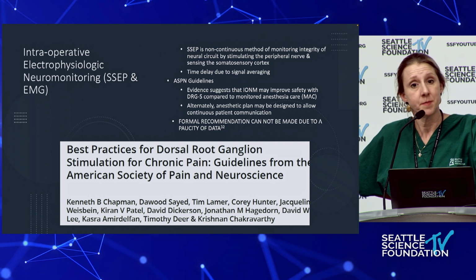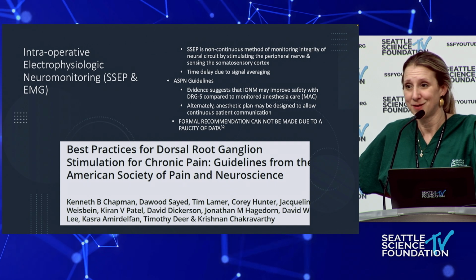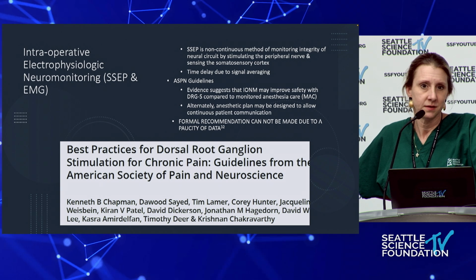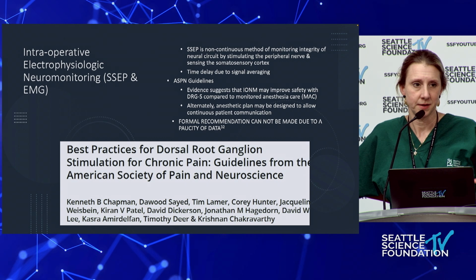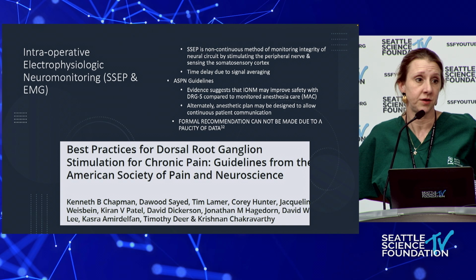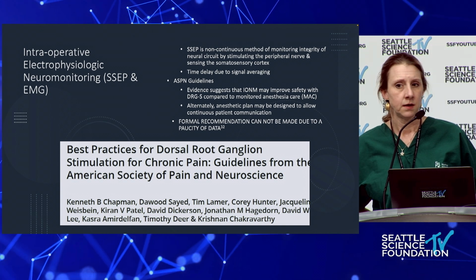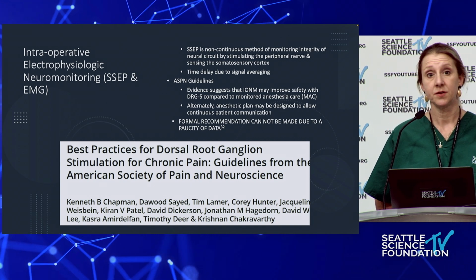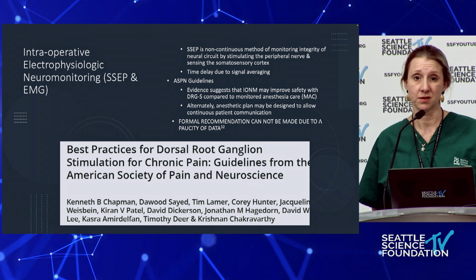I mean, all of the medications, save fentanyl and midazolam in lower doses, are going to have an impact on the electric monitoring as well. So I think that it's always a complex decision, but relative to the specific concern, I think you can rely on your judgment. There is not a strong recommendation to have electrophysiologic monitoring. Among the faculty here, do you do electrophysiologic monitoring? Okay. I have not either. But I work with anesthesia to make sure in these cases specifically that I'm able to communicate with my patient.